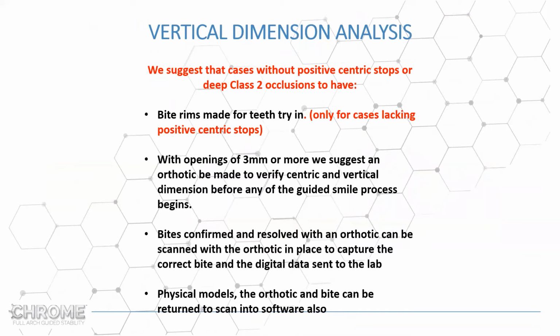So, vertical dimension analysis. Of all the issues that we have, the attention to vertical dimension on these kinds of cases is the one that is not addressed enough, the least part of this work, that is ignored or just not thought about. Let's put it that way.